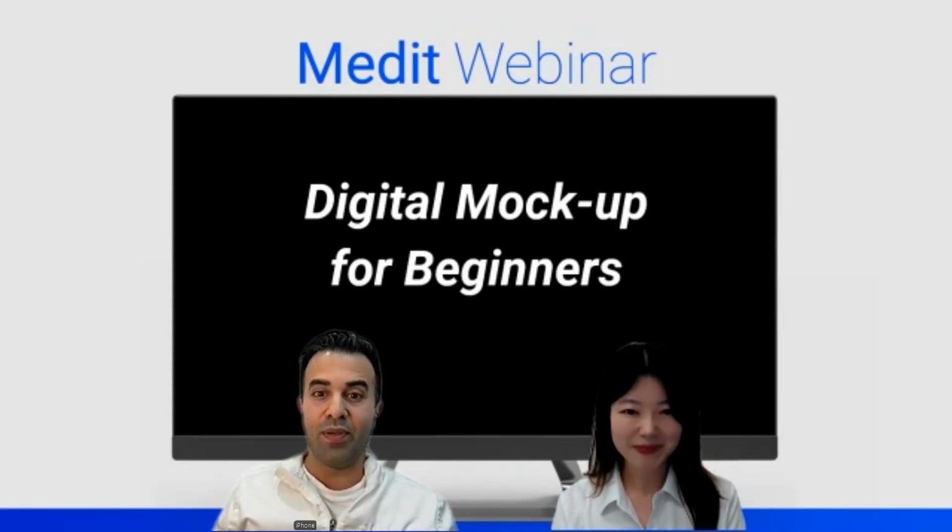It's a pleasure to be here, and it is my honor to speak to the Medit team and to present a topic that I'm passionate about, which is the digital mockup.